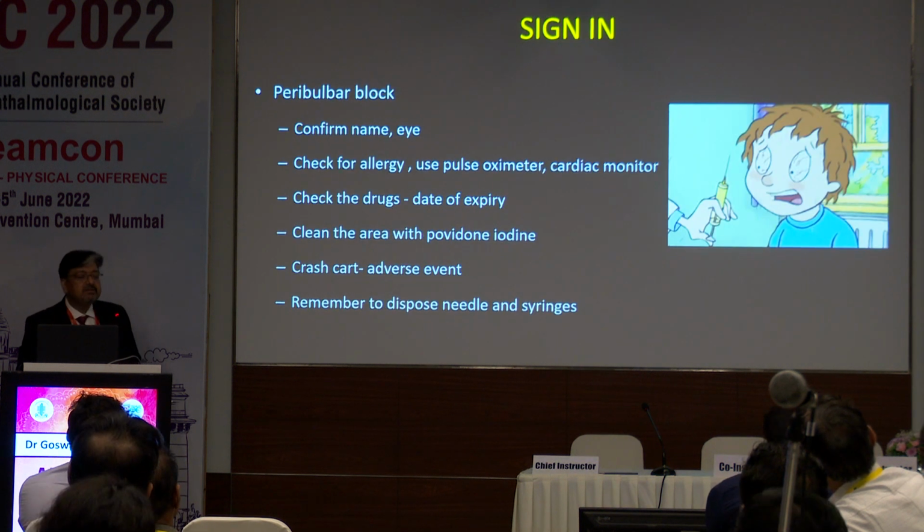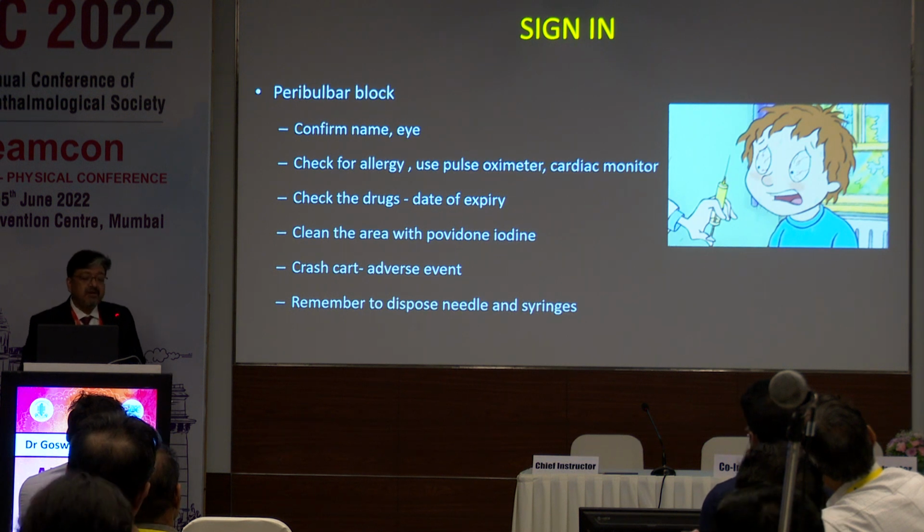So sign-in, as I said, in peribulbar block, you should have preferably a crash cart, which should take care of any adverse events during the injection process.